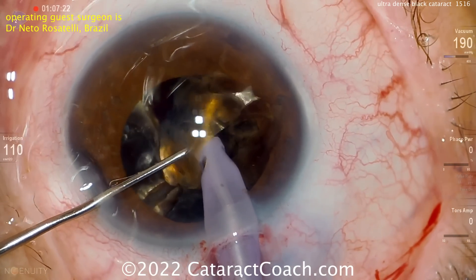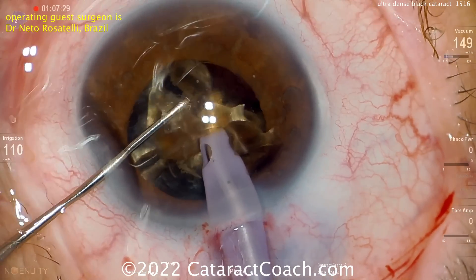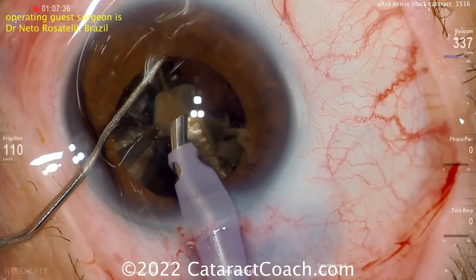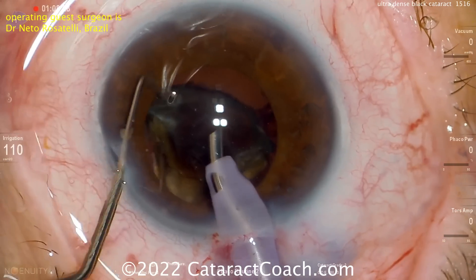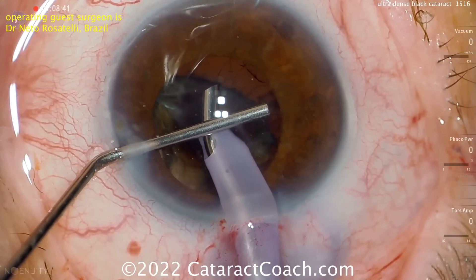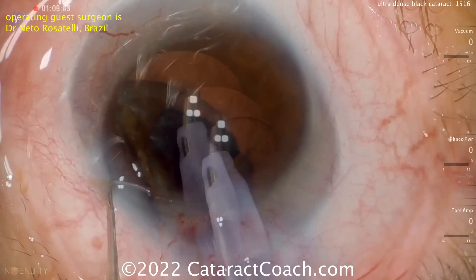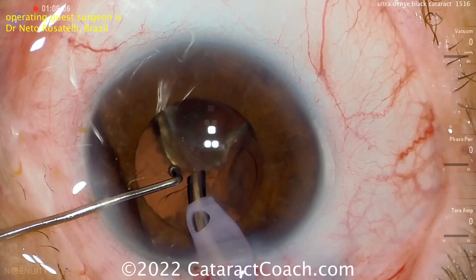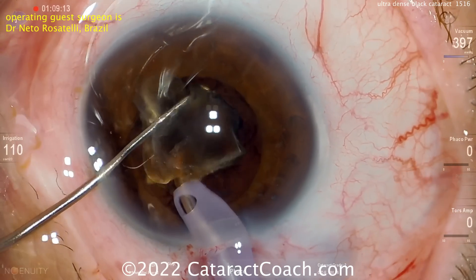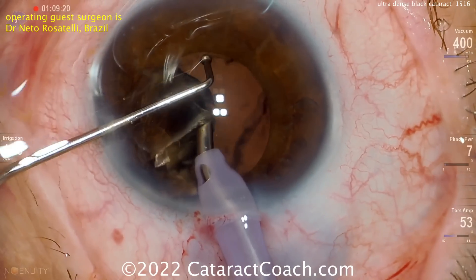You can try chopping into smaller sub-pieces and then emulsify them down. Even then, some pieces don't want to really split, so probably the easier approach is to just buzz through it with more phaco energy. Use phaco power modulation to minimize energy — probably a pulse mode with a duty cycle of around 50% or so. Slowly but surely you can remove this nucleus. Notice how many times he's recoated the endothelium and filled the eye with viscoelastic, likely HPMC (hydroxypropylmethylcellulose) via a 25-gauge cannula. It's okay to use a couple of syringes' worth — viscoelastic is cheaper than vitreous, and cheaper than corneal endothelial cells.